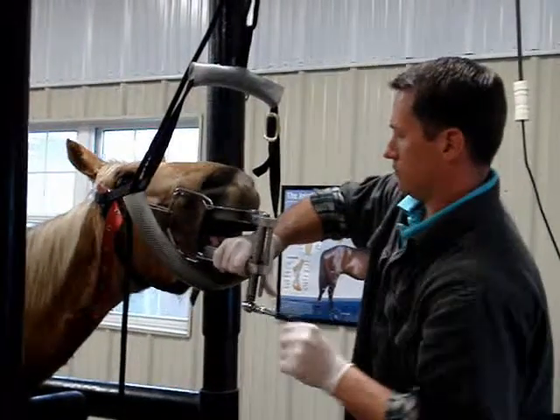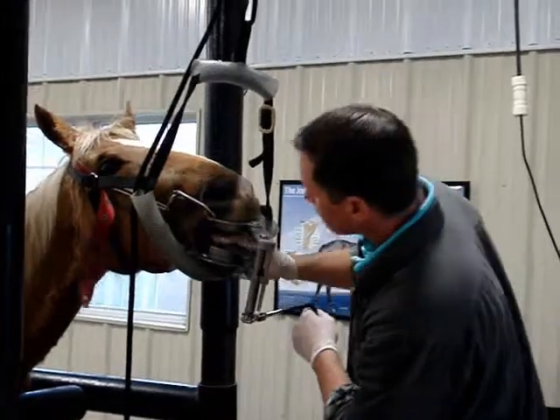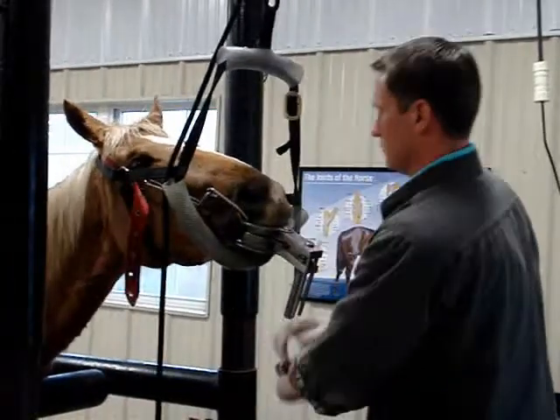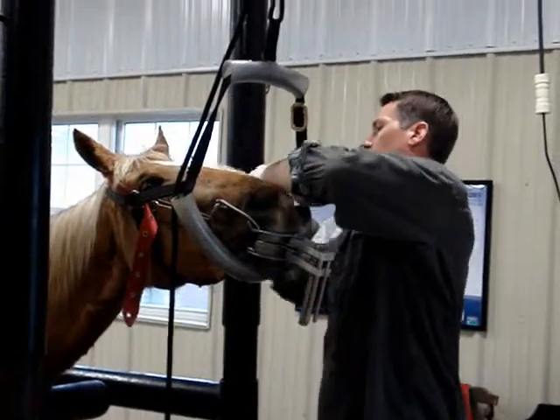The speculum will be cranked down and then removed from the mouth. The incisors will be evaluated at this point. While the horse may appear to be quite sleepy, most horses are very steady on their feet, and most will be ready to trailer home in about 15 minutes.